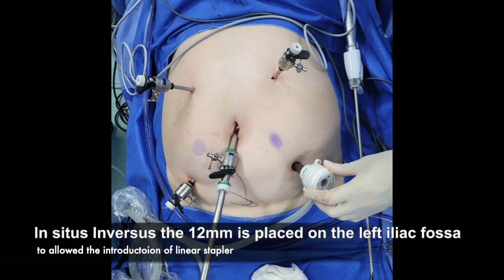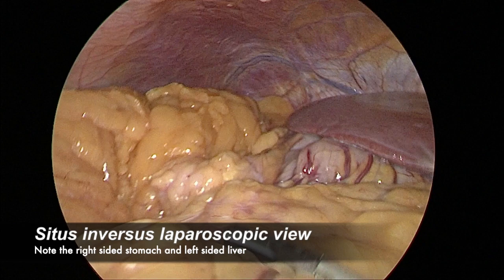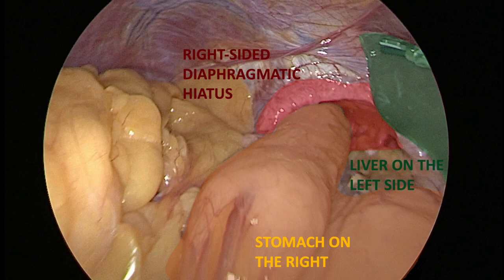Upon entering the abdominal cavity, we can confirm situs inversus through the mirror image, with the liver on the left side, the diaphragmatic hiatus, and the stomach greater curvature on the right side of the patient.